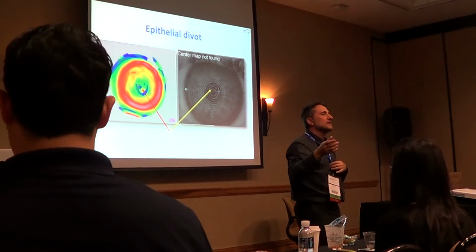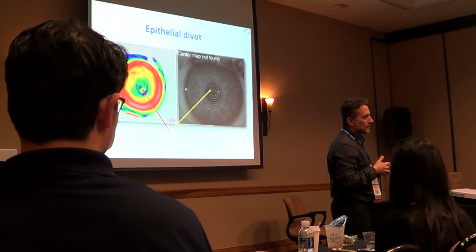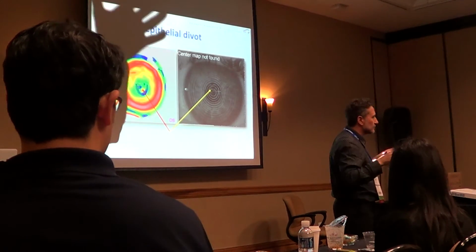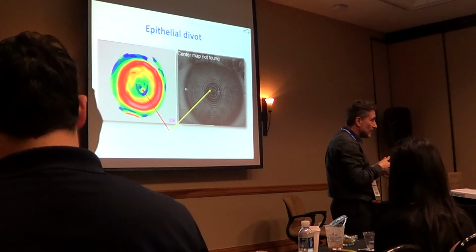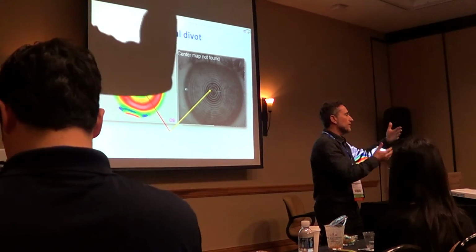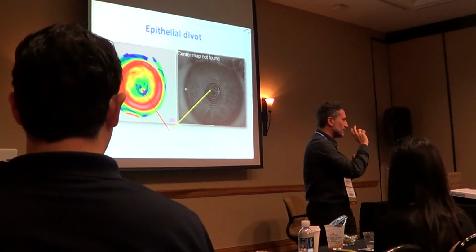Even if I don't release the patient for 20 minutes in the waiting area, I strongly recommend it at the beginning. And after that, do the first overnight trial. But when you have some experience with the fluorescein pattern after 3-4 minutes wearing, you are ready to say, okay, you could wear these lenses overnight or not. You don't need more steps, but at the beginning, it's strongly recommended. Leave for 20 minutes, look at the fluorescein again after 20 minutes, look at the topography map in the differential to see the centering, the issues and so on, look for health and so on, every step at the beginning. But after that, you could move on and make things quicker.